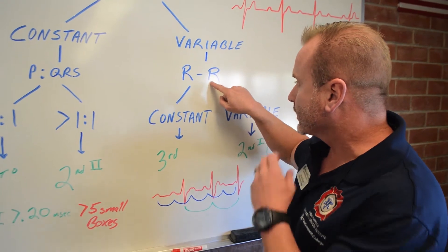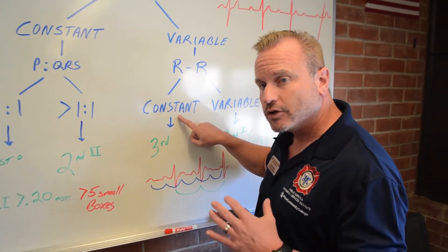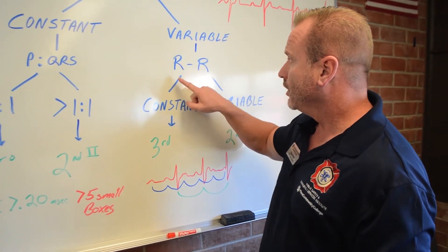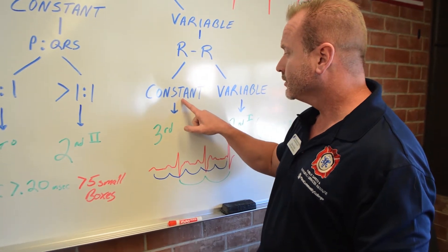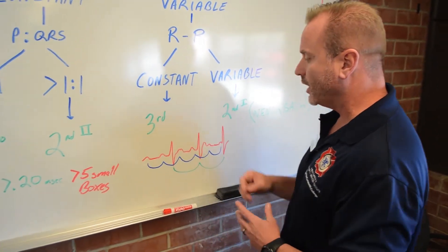Well, with a third degree, it should be variable. Our R to R complex is constant. This is what makes deciphering a third degree so fundamentally easy. And when we go over it, you'll see it. So my PR is variable. My RR is constant. I have a third degree AV block.